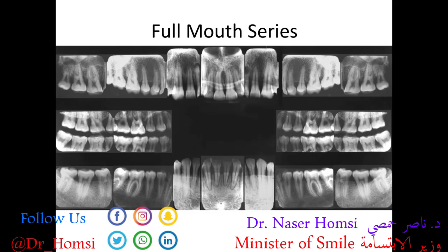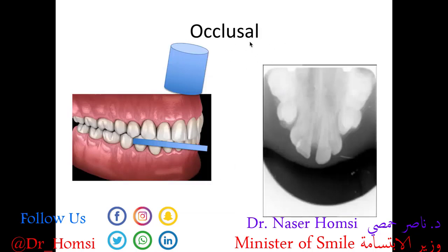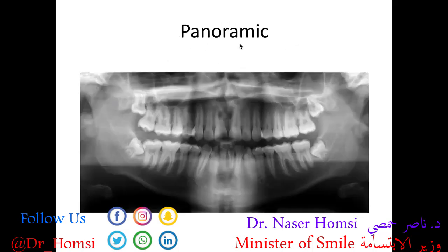If you put a routine collection of bite wings and periapicals together, you get a full mouth series. The full mouth series collectively captures every tooth, every root, and every contact point between each tooth. We also have the occlusal x-ray, where the x-ray beam comes from either above or below the teeth — good for tooth or bone fractures from trauma, eruption patterns, and other things. The panoramic x-ray is an extraoral x-ray that provides a frontal view of all the teeth — patient's right on the left and left on the right — and is great for jaw pathology, developing and missing teeth, evaluating wisdom teeth, and many other big-picture things that intraoral radiographs cannot capture.